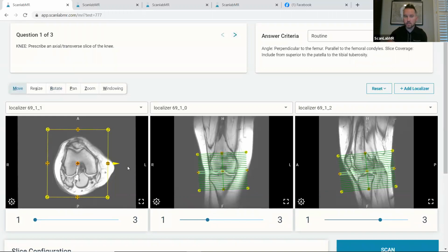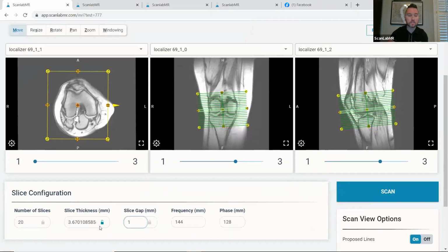Okay, sounds good. You'll see we also want to be right to left. So that popliteal artery is phasing right to left. Now, I want to get all the way to the insertion right here at the tibial tuberosity and a little bit higher, but let's mess that up as well. We don't quite get there. Oh, and since I'm on slice thickness, there we go. Take this back to 3. There we go. So now we can add or remove.